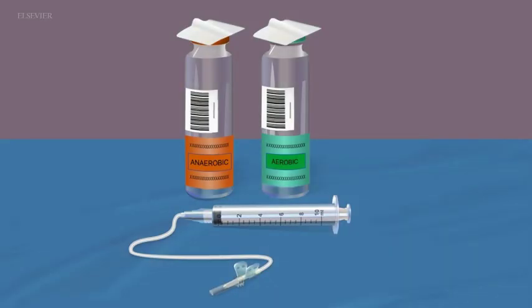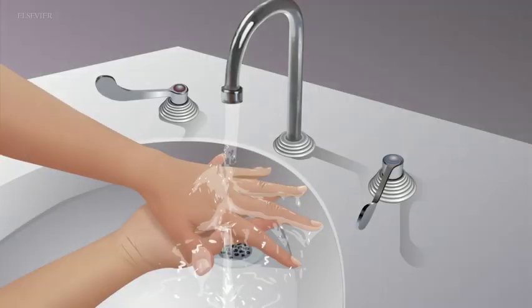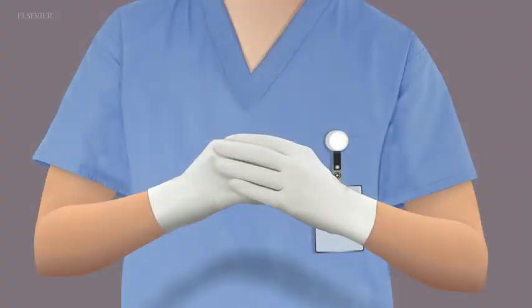If using a winged butterfly or straight needle attached to a syringe, position the culture bottle securely upright and place a sterile transfer device housing a rubber-sheathed needle within reach. Relocate the selected venipuncture site. Perform hand hygiene and don gloves.